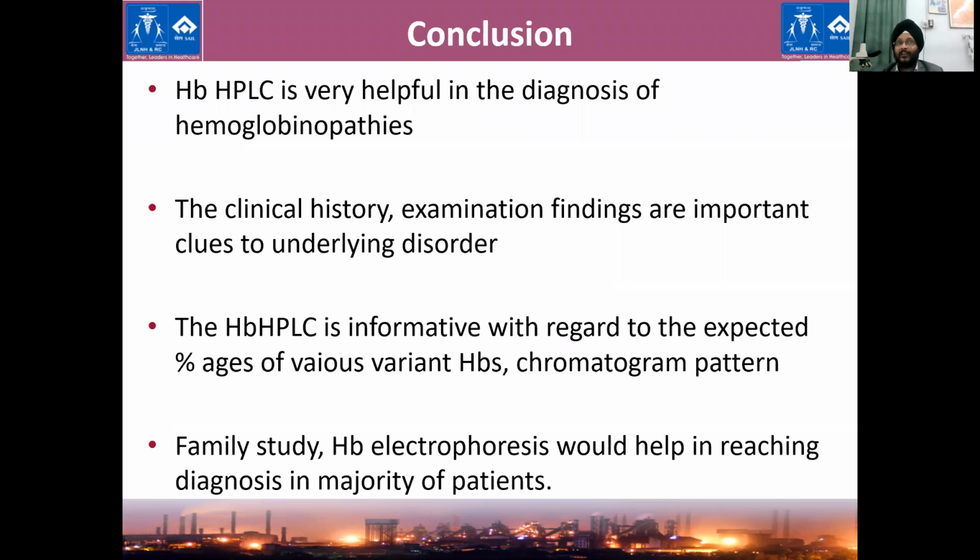Now the second part is the difference between acidic and alkaline. The most commonly used is alkaline electrophoresis because it is easier to standardize. Everyone who has read pathology, as I did a few years back, knows that this electrophoresis was very commonly done, and we are very well versed in it. But acidic electrophoresis is very difficult to standardize, so it is not very commonly used.